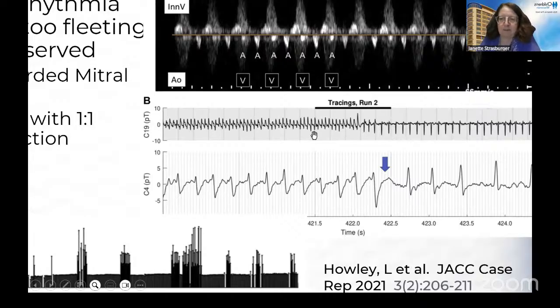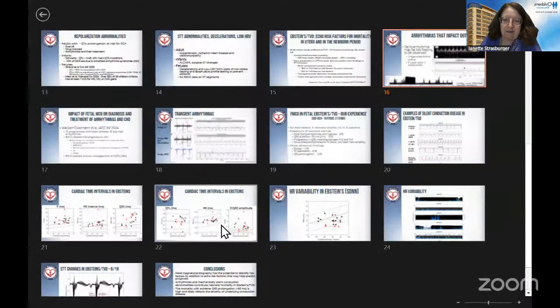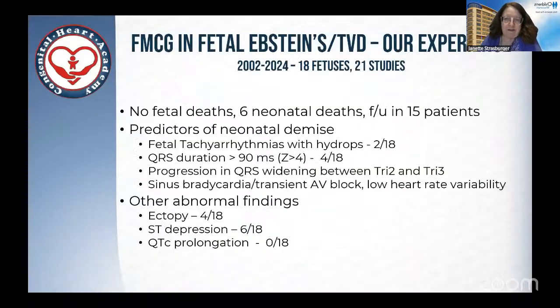And it wasn't really appreciated because if you look down here at the heart rate trend graph, the heart rates are only high during a small percentage of time. This is less than 30 seconds. So that's barely enough time to put gel on the transducer. So I think this can easily be missed by echocardiography and has important implications for the overall long-term effects on the fetus.